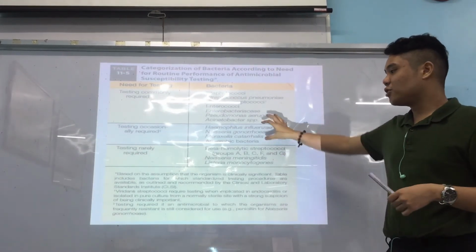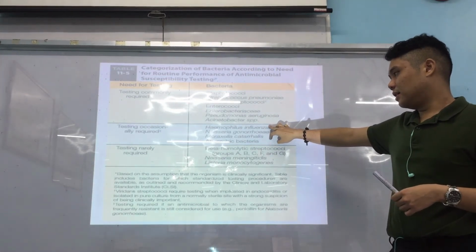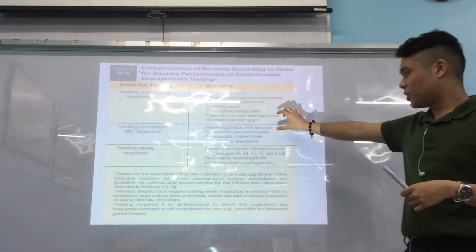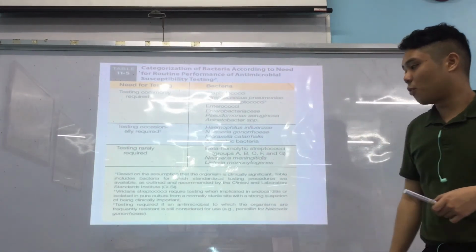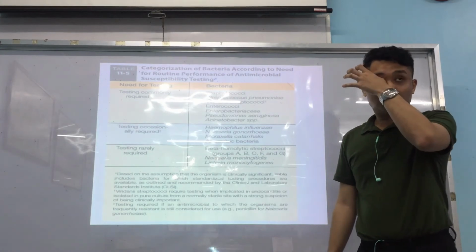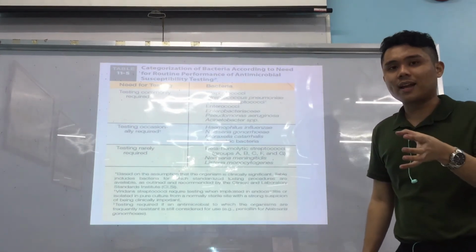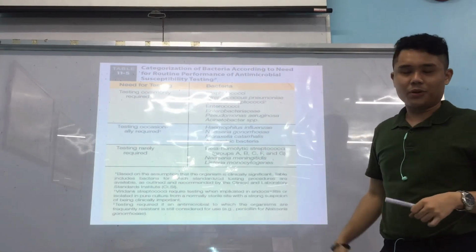Okay? Alright, and occasionally required, testing required if an antimicrobial to which the organisms na adhere are frequently resistant is still considered for use. Okay. Alright. So, kanisa na mga organisms, we test them because again, naay ubang mga drugs na considered resistant na pero ginagamit ra gyapon. So we test them. Occasionally required ra pod. Okay?